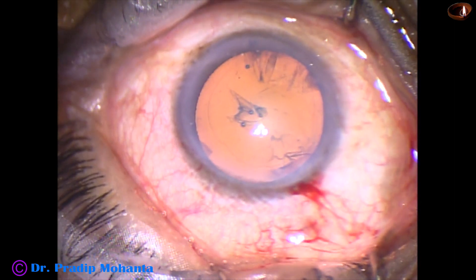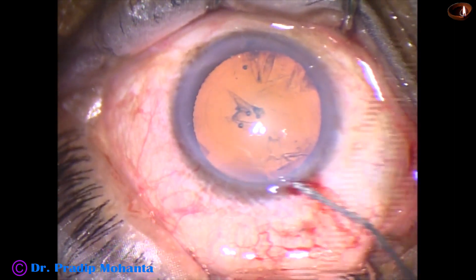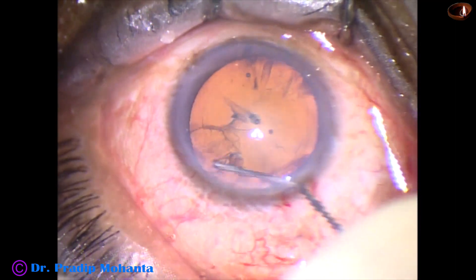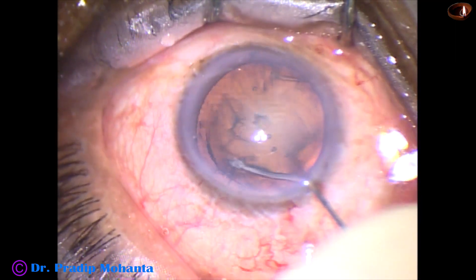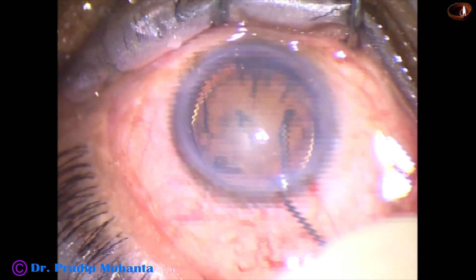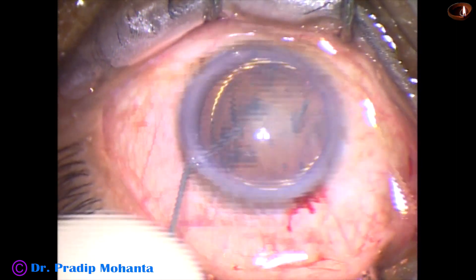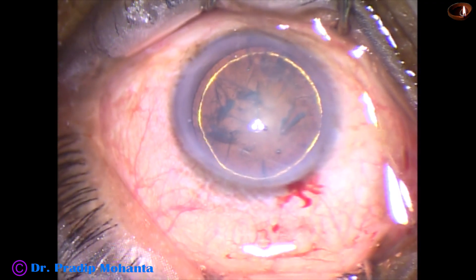And now, hydrodissection. BSS is passed just under the anterior capsular rim after expressing out some visco from the anterior chamber. The nucleus is tapped and the nucleus is rotated.